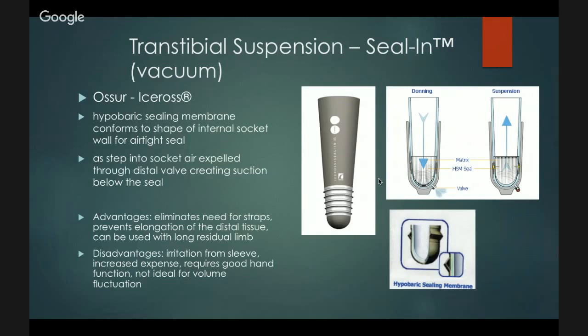So generally, one, I never use this for somebody's preparatory prosthesis, the first leg that somebody gets when they start walking, because their residual limb volume hasn't matured yet. Most people shrink down. So I would never start off with this system. I've come into too many problems where people come in with them and right off the bat we have fit issues. And two, if I expect that their volume is going to be fluctuating too much even down the line, this isn't something I'd use.